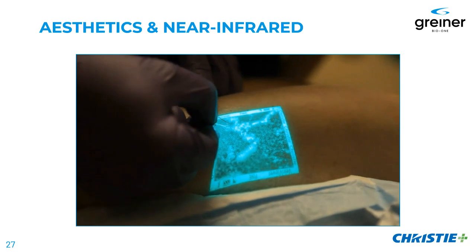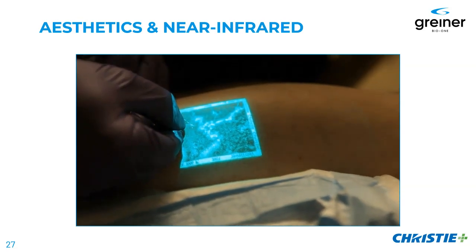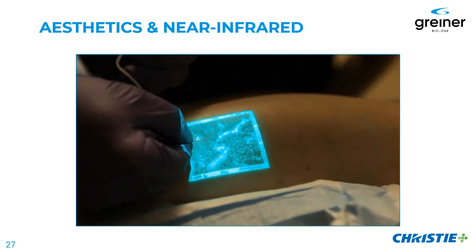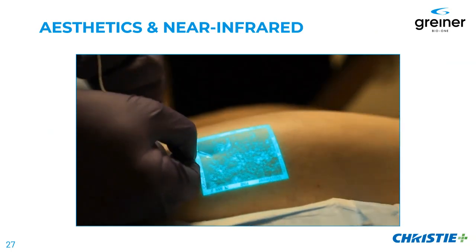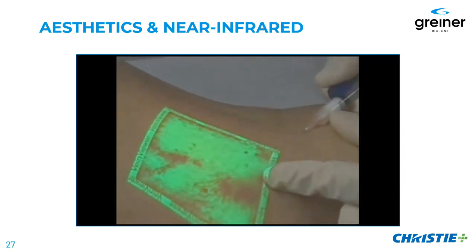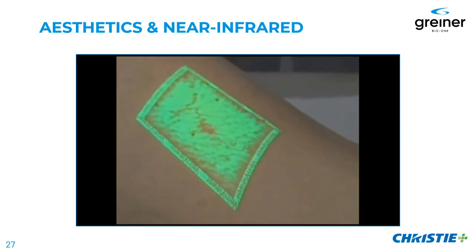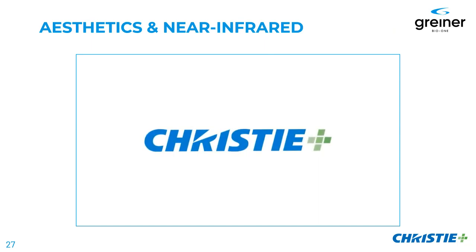This is an example of a sclerotherapy procedure where the light is actually used. So this speaks to medication, proper medication management, and being a good steward of our pharmacologies. So as you track the injection up the leg, you can see where it goes and also where it stops. And you can see the results there, the vein is actually closed. As you track the agent up the leg, you can see how far the ablation occurs and where you would need to inject next, which obviously maximizes the procedure and exposes the patient to less pharmacology, right? We always want to do the most with the least invasive that we can do.